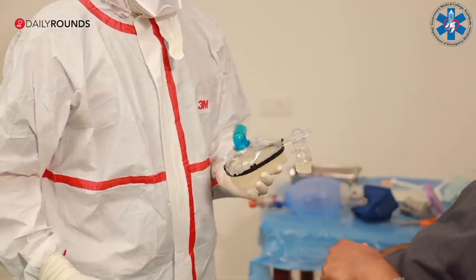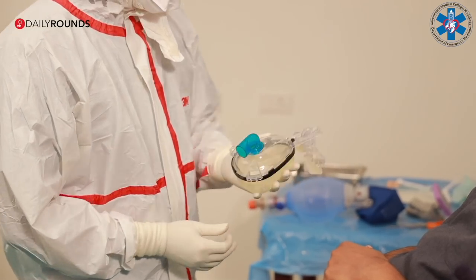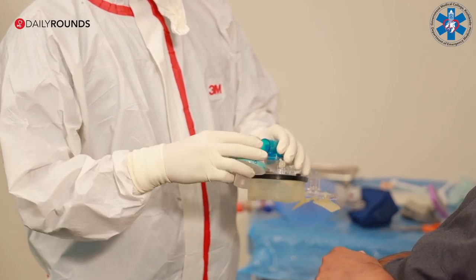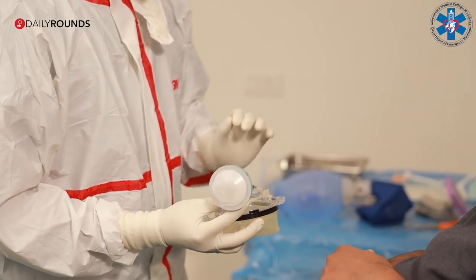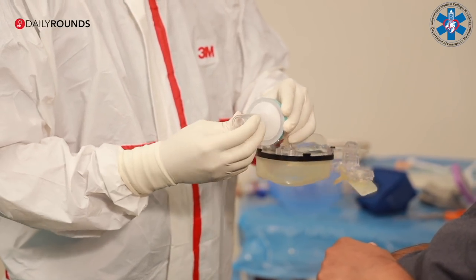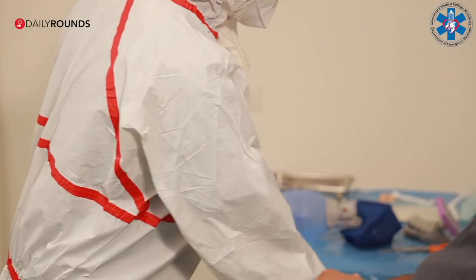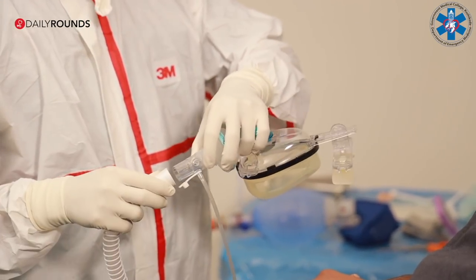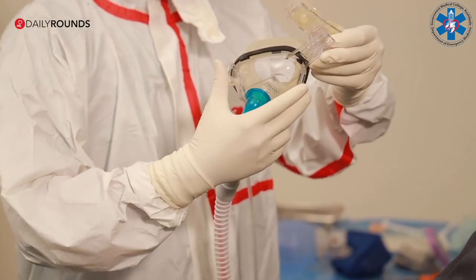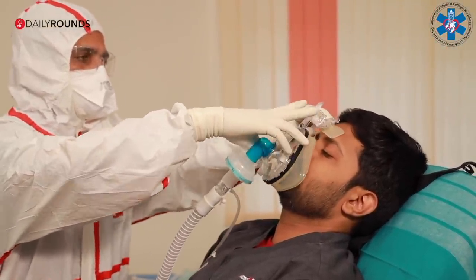So in these patients, we are going to choose a non-vented NIV mask of appropriate size. To this, you need to attach your viral filter. Make sure that this is a viral filter and not an HME filter only. And after this, now you need to provide an extra expiratory port, to which you can also attach your oxygen. And finally, this is attached to your single limb NIV circuit. This can help to prevent or reduce the dispersion of aerosols generated by non-invasive ventilation.